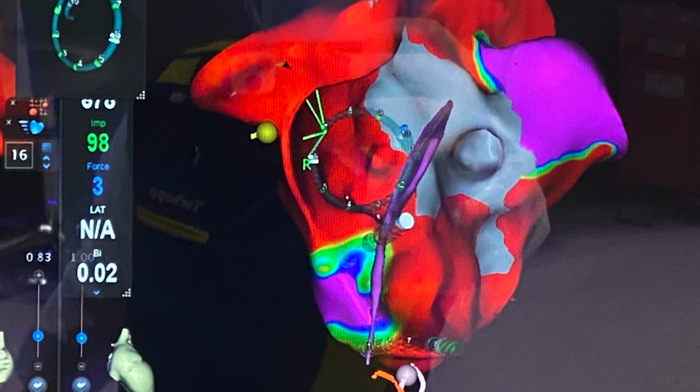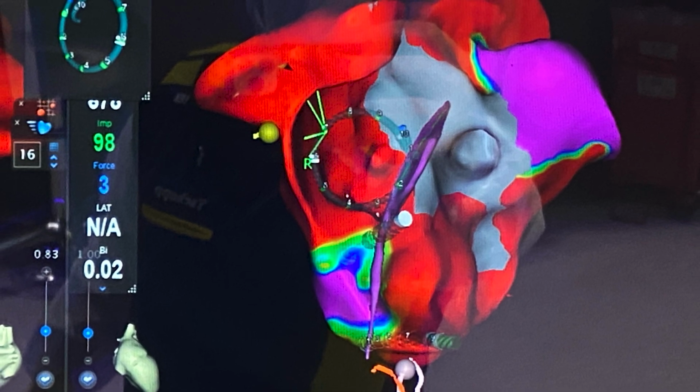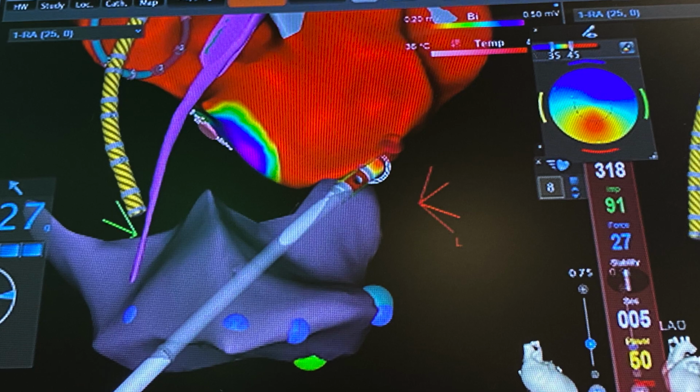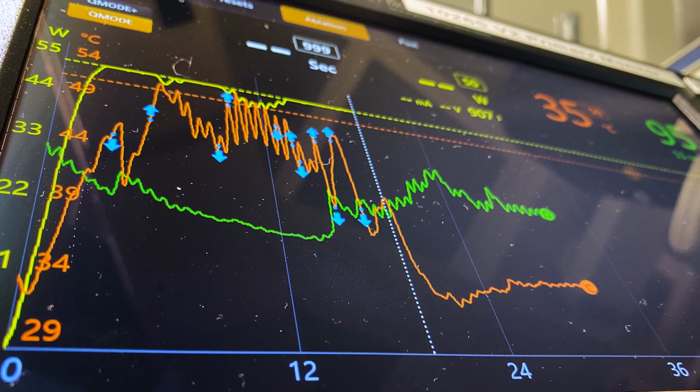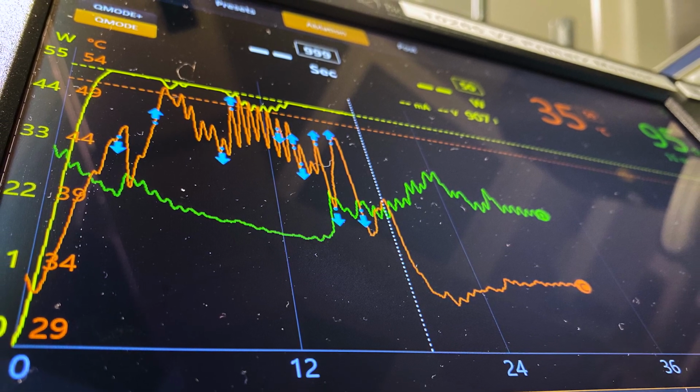There are two options. One, you can go to 90 watts for 4 seconds, or you can drive to a maximum of 50 watts based on tissue temperature. It took all of the things that had been iterated in the past, and then we were able to measure direct temperatures. Plus, you could use high power for very short duration lesions, and looking at it from a biophysics standpoint, that will generally cause you to have a much shallower lesion. So if you only want to ablate 2 millimeters or 3 millimeters of depth, you can dial it in that way, whereas you couldn't really do that with the prior technologies.